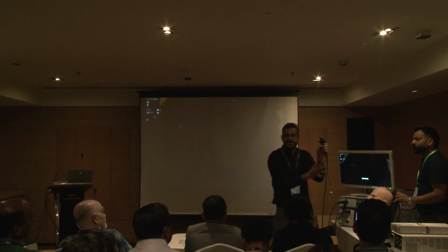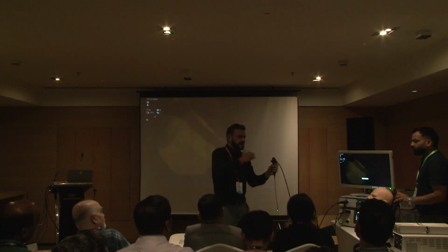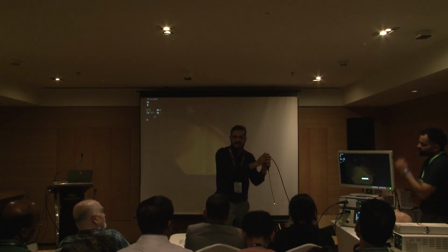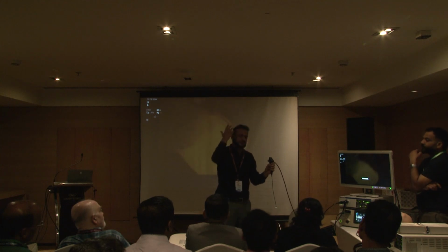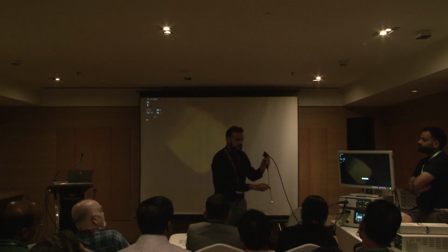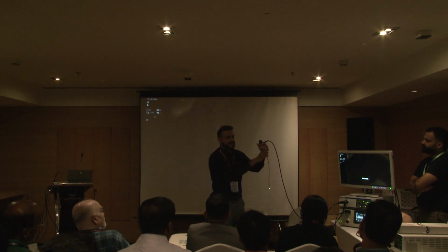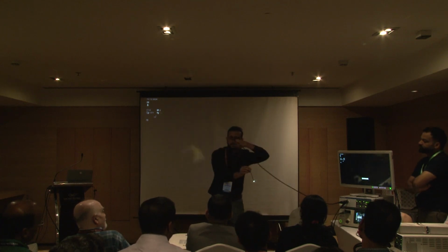Second, all these flexible scopes are a modification of the esophagus scope which was made first, and then they thought, okay, we can see the larynx also with this. See how he is putting an esophagus scope. He will hold it like this, and he will go inside like this. So this gives him a movement.